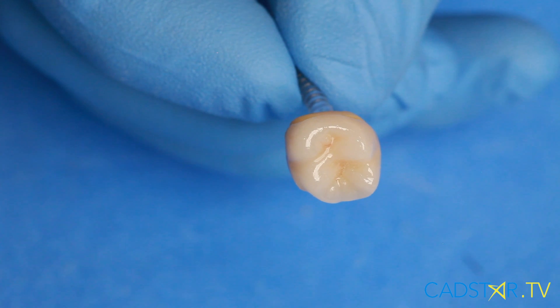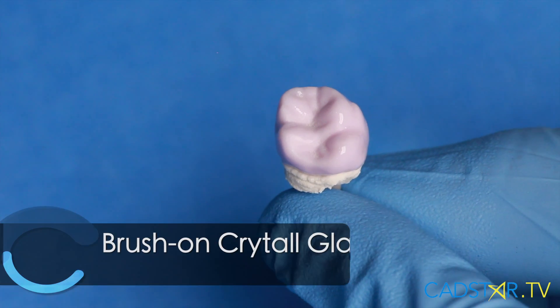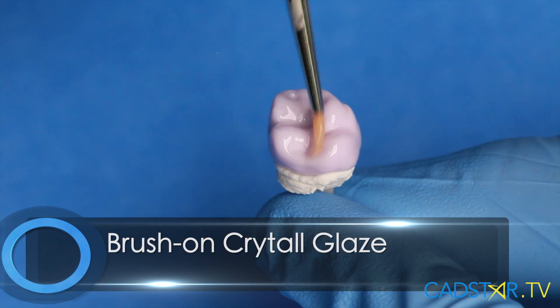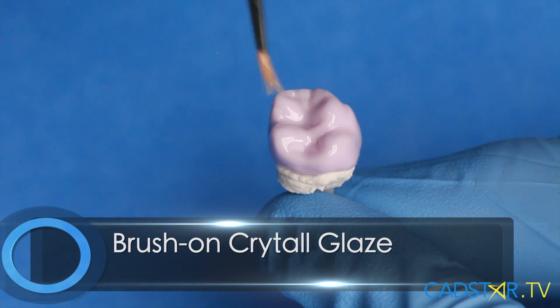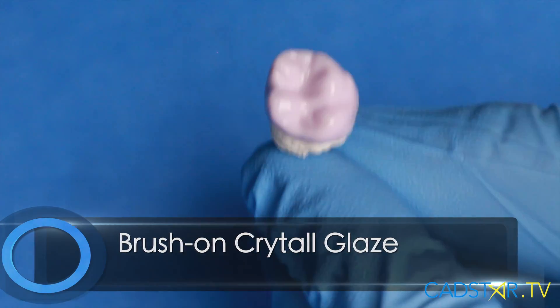The secret to finishing Emax — and we want to avoid bubbling with our glaze — whether I'm using the fast new accelerated cycle or traditional cycles using crystal glaze, I just don't get bubbling. Part of the reason for that is that I thin my glaze out enough to remove any excess organic material that may not dry off as you're firing your restoration, which creates the bubbling.